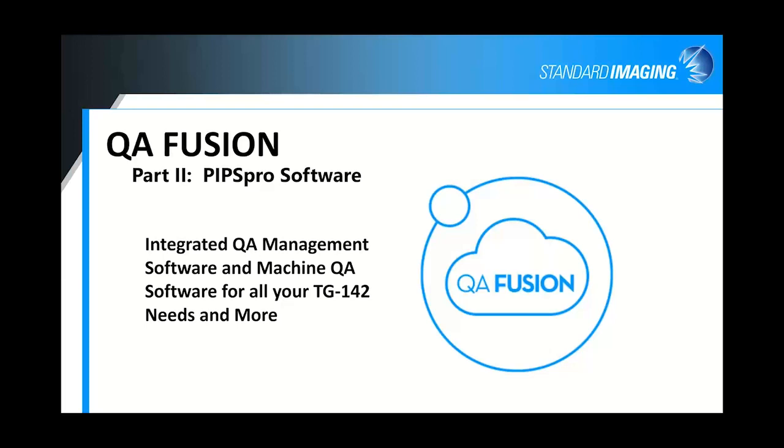Hello, my name is Hugh Peterson. I'm the product manager for standard imaging for our PIPSpro software, which I will be giving you an overview of today. And actually, I just want to introduce you to our QA Fusion package. The QA Fusion package is a combination of our PIPSpro software for the actual QA test functionality, as well as our QA Pilot package, which is our cloud-based QA management software.